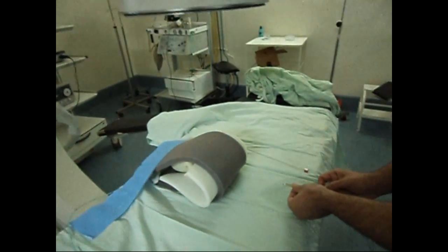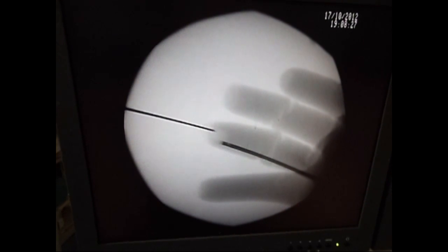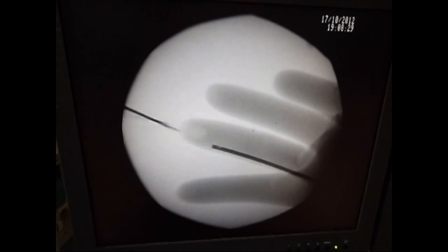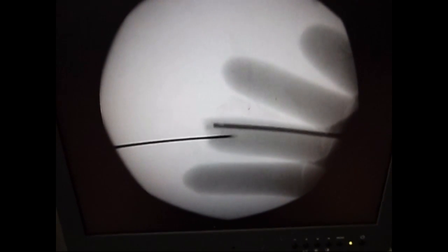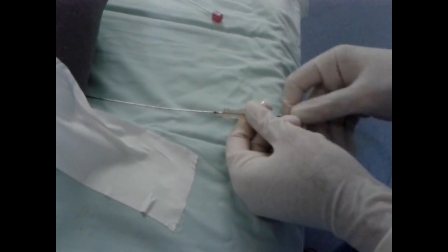An 18 gauge needle is used for puncture. The foam gives an almost similar feel to the abdominal wall. Needle puncture of the finger's tip is similar to a calyx puncture — the needle moves and pushes the glove's tip as when moving a calyx. A clear fluid appears from the needle.